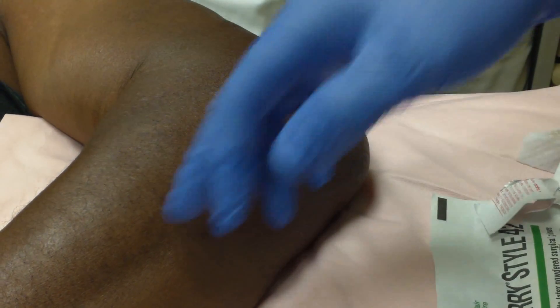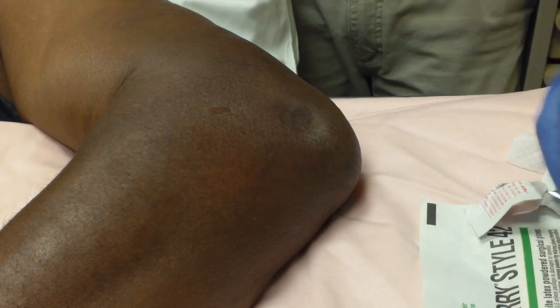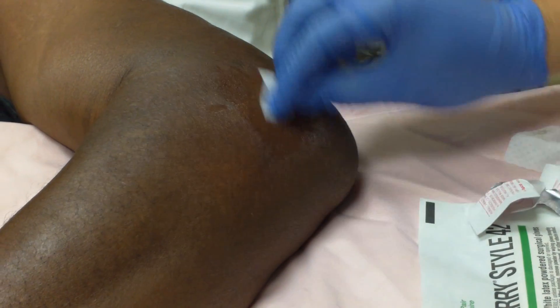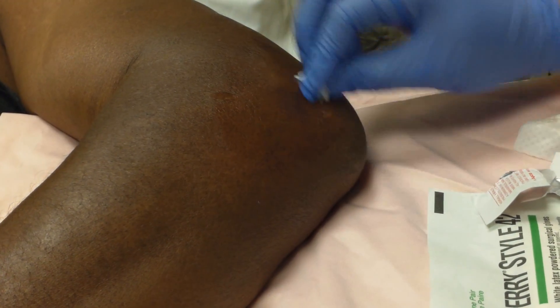We have the patient 90 degrees flexed with his hand pronated to give us the best access point. First thing we're going to do is some numbing medication using lidocaine.